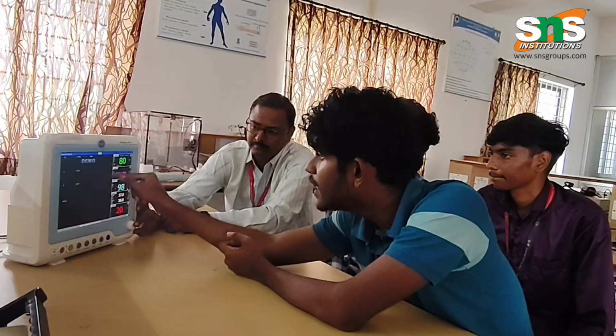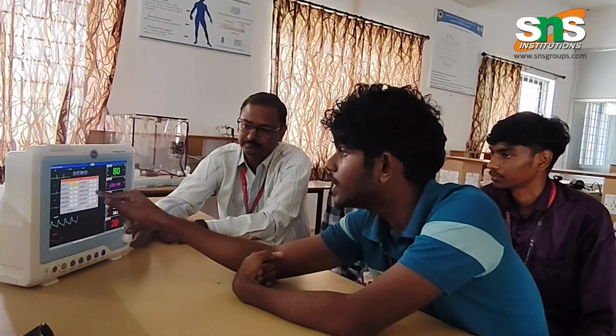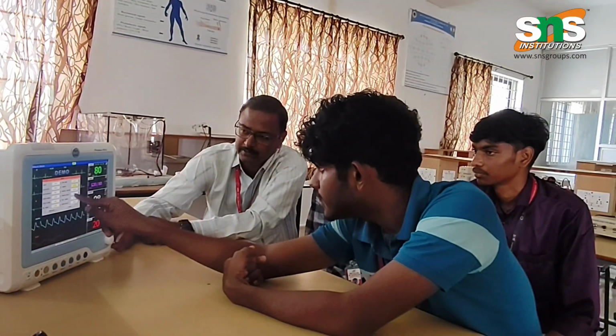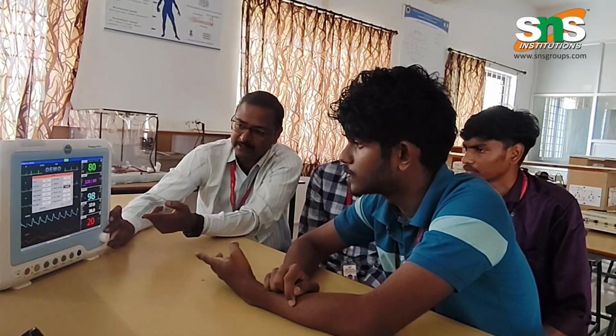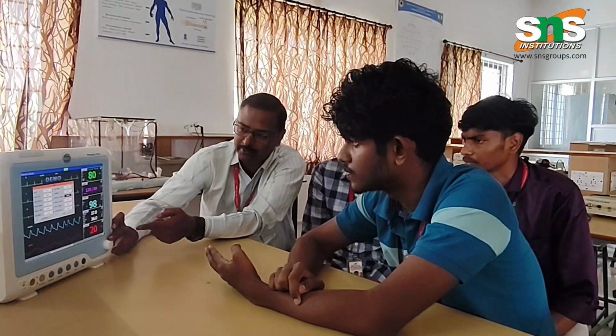After that, we have sweep, and we can even change the color of the wave here. We can change the color to yellow or some other colors. Now I go to the wave color pattern. If I click the color, it will be highlighted, and I can rotate this knob and change it to blue or pink.